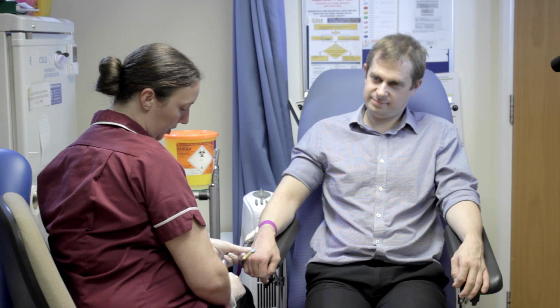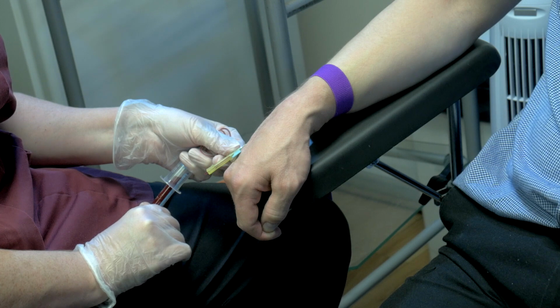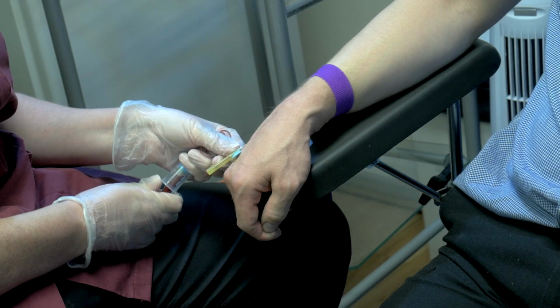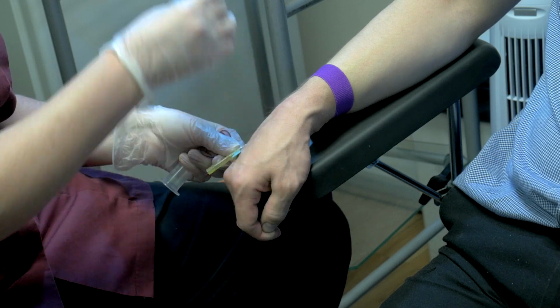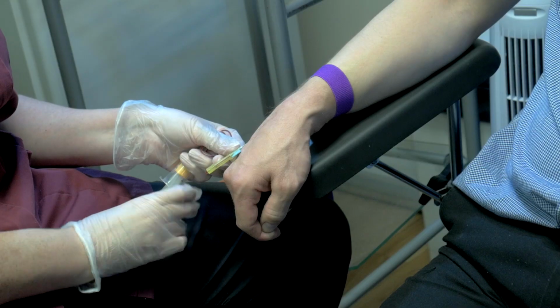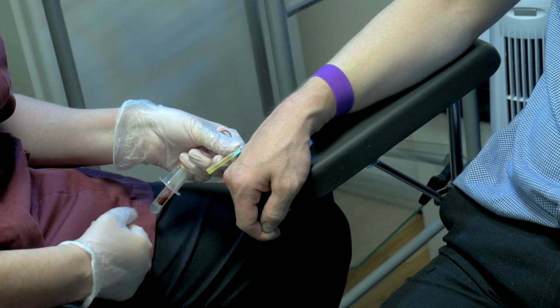With the light blue tubes, it's really important that they are full to the fill line, otherwise they will be rejected by the lab. So we need to make sure that it hits that mark. So once that's done, I'm going to take it off, hold it up just to make sure it's full to the dark blue square. And then I'm going to pop it down and get my gold tube and pop that on and wait for this to fill.